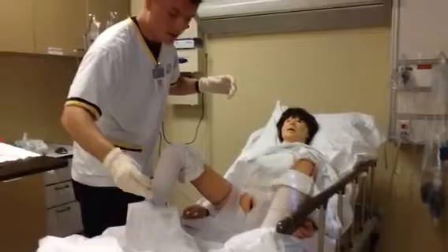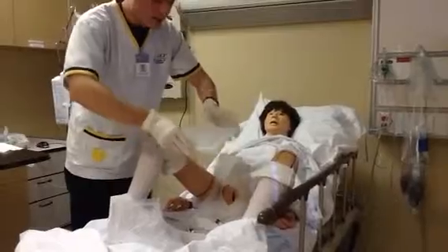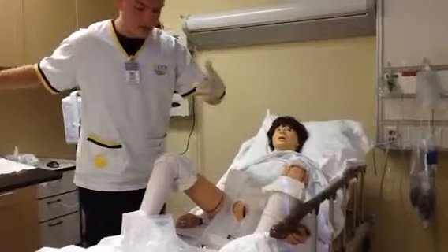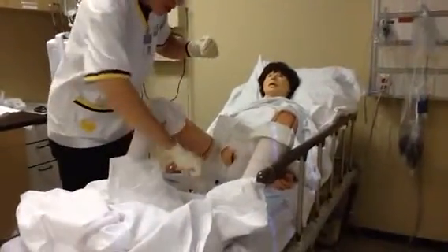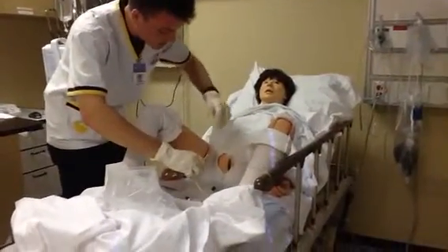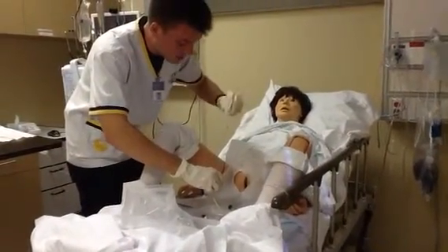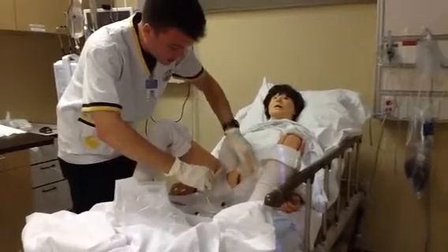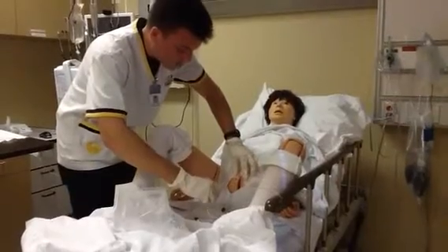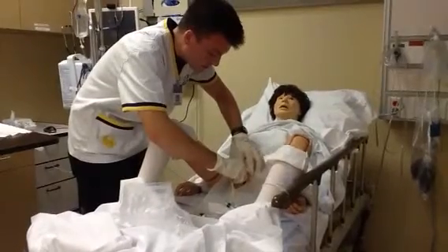So at this time, my cotton swabs have been used. I'm going to pick this up and making sure that I keep my body facing my current sterile field, I'm going to drop that out of the way, no longer needed. And we are ready for catheter insertion. So I'm going to tell Mrs. Knight at this time, I'm going to bear down, about to insert the catheter. I'm going to take my left hand and I'm going to contaminate it by touching the labia. At this point I can adjust my drape as needed. I will spread the labia and I will tell her, alright Miss Knight, go ahead and bear down. I'm going to insert the catheter and feel some pressure.